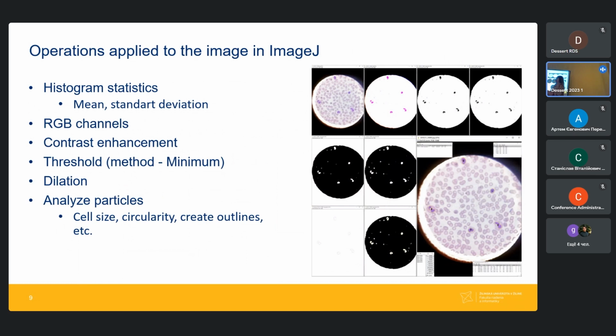Partly yes, partly no. At the end, it just gets to black and white. So when you see the white thing, it knows it's the cell. When you see the black, it's the rest. But to get there, there is the process diagram, then black and white.